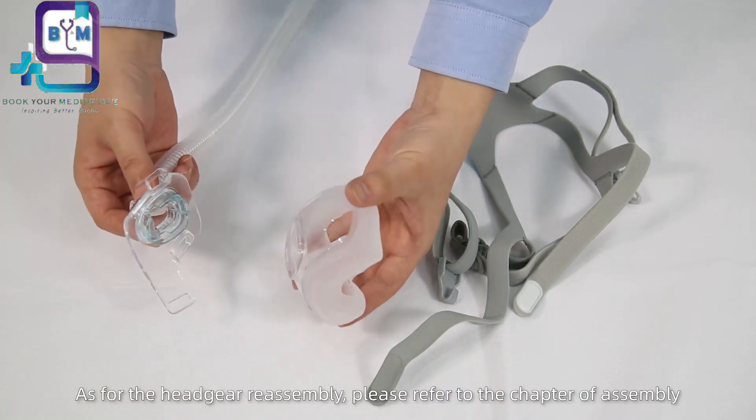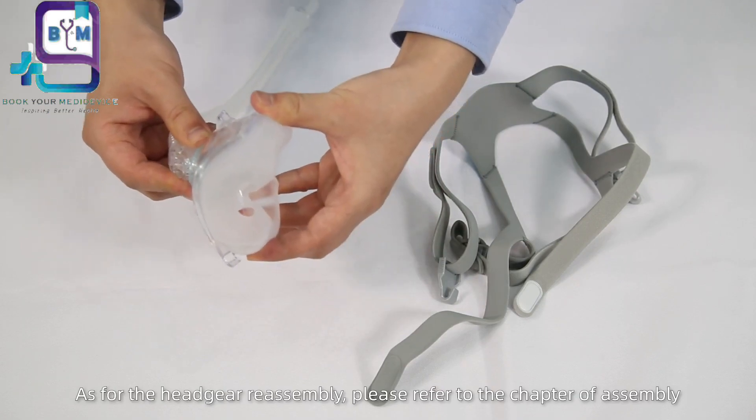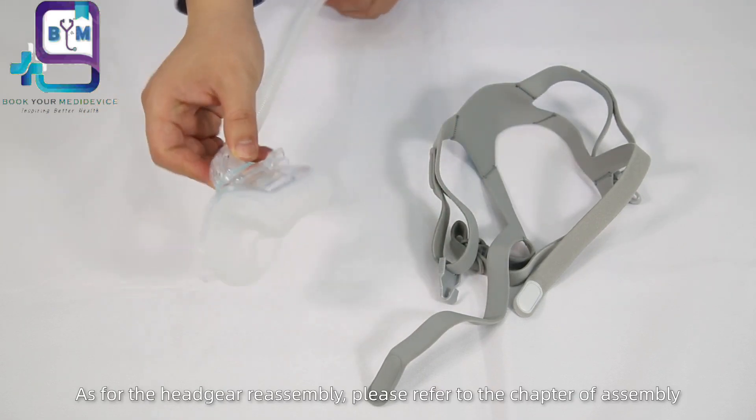As for the headgear reassembly, please refer to the chapter on assembly.